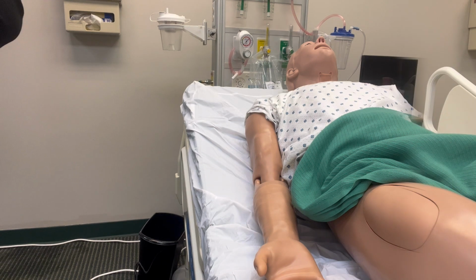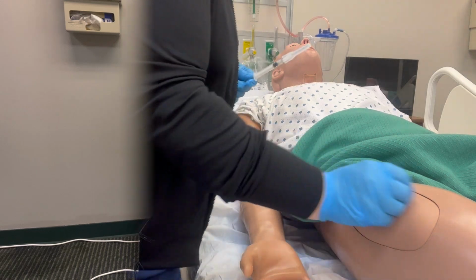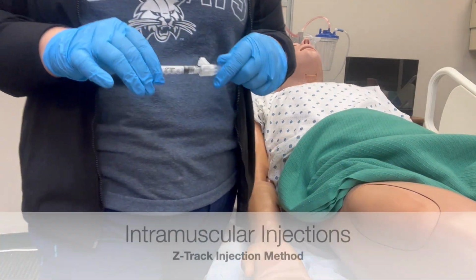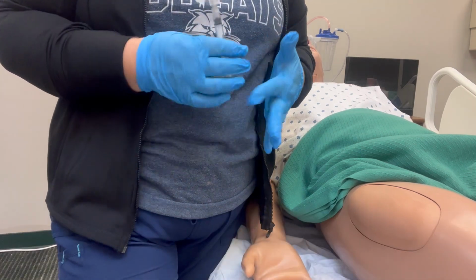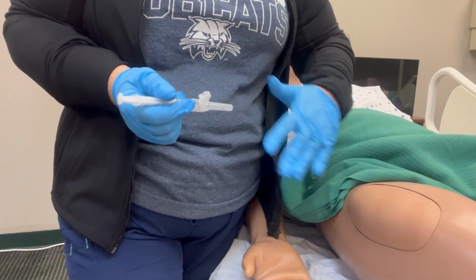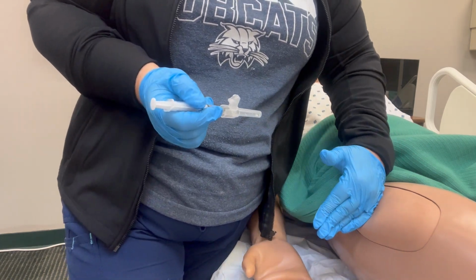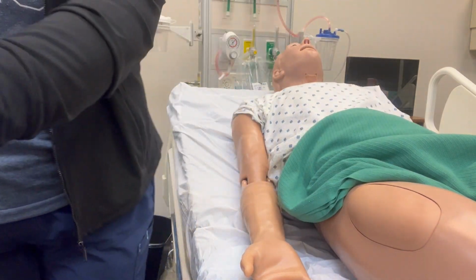Now for the Z-track method. Again, we're going to clean our site. The Z-track method is commonly used for medications that could cause damage to the surface of the skin or stain it. So for the Z-track method, instead of pulling the skin taut between our fingers, we're going to take the side of our non-dominant hand and pull the skin towards us or away from us, however is easier for you.